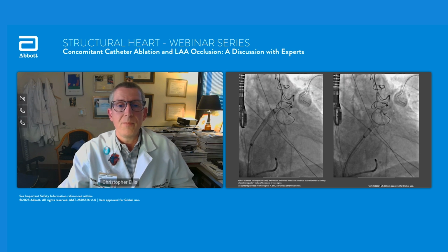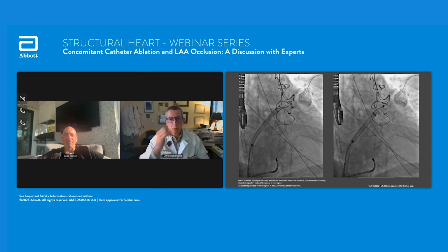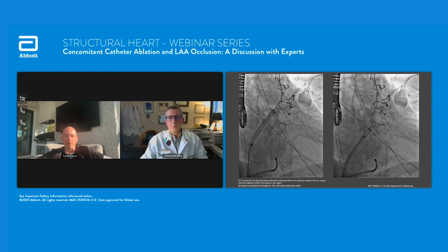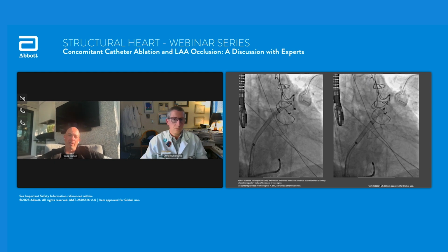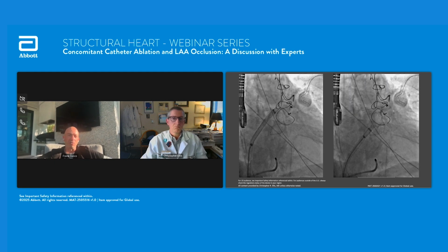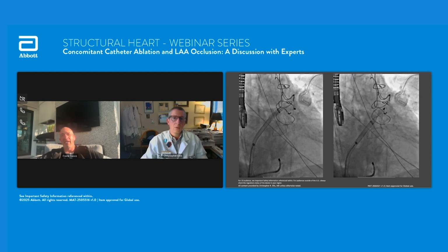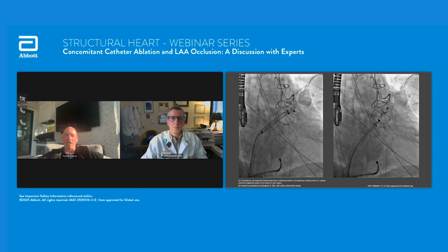My decision to do the CTI and SVC is usually made before the procedure. Obviously if I wasn't planning on doing it and they come back, that can throw a wrinkle in it, but I generally will do those first, Chris. So basically my workflow is to do the right atrial work first and then do the left atrial work and be done. I obviously use a lot of Farapulse too. And so what I'll typically do is go in and make my right atrial map as I'm going, and I'll isolate the SVC and do the CTI first.